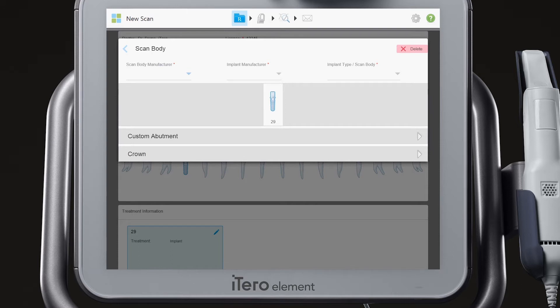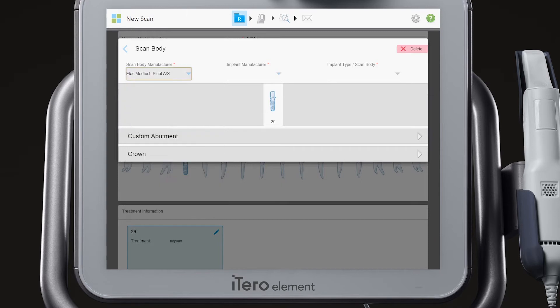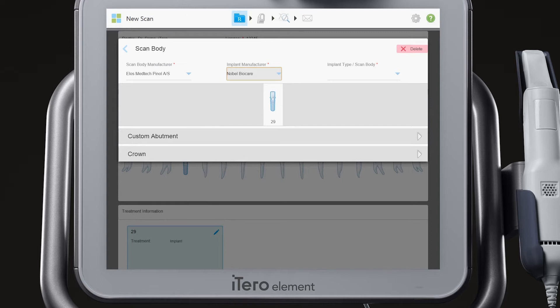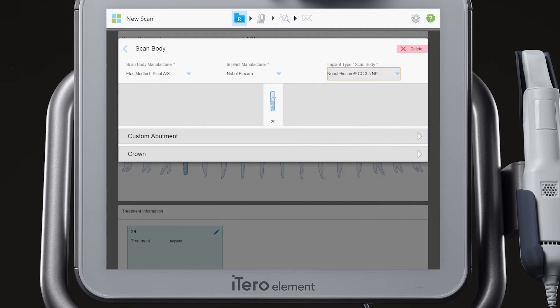Next, you will choose the lab or milling center that you acquired the scannable piece from. In this case, we will choose the ELO Scan Body. Next, choose the Scan Body implant brand. In this case, we will choose Nobel BioCare. Last, choose the size of the implant branded Scan Body.